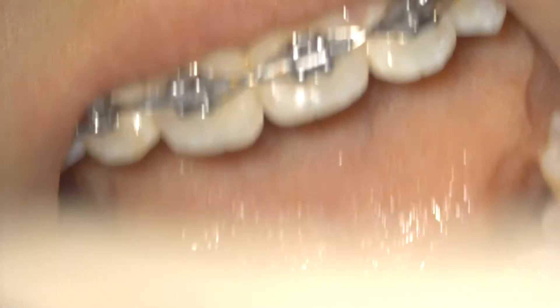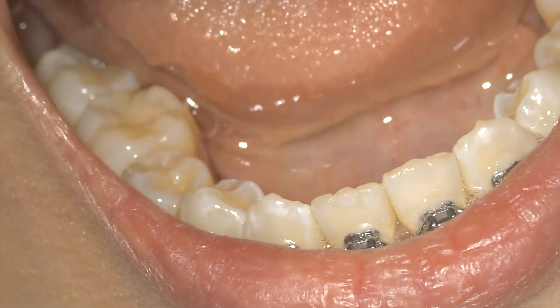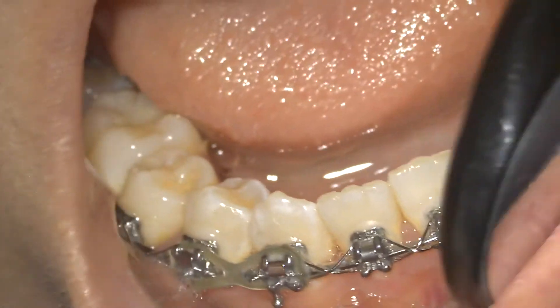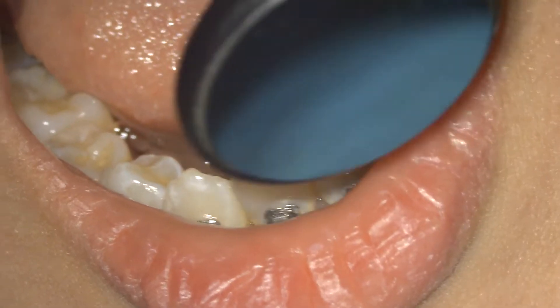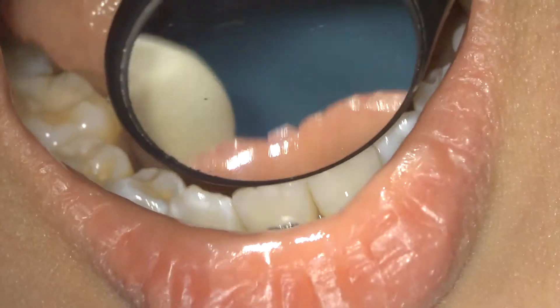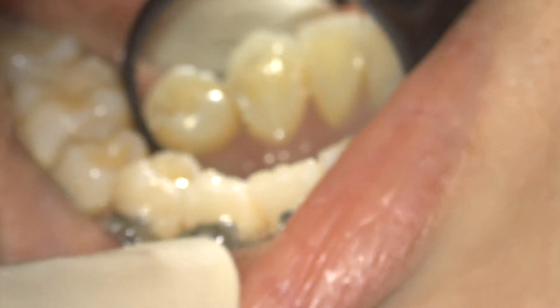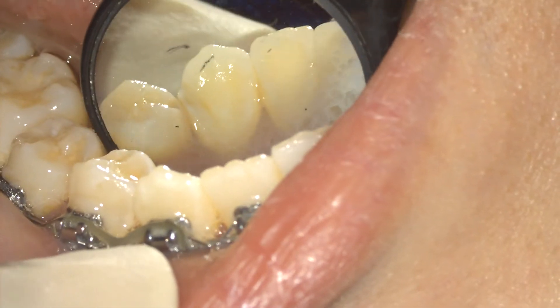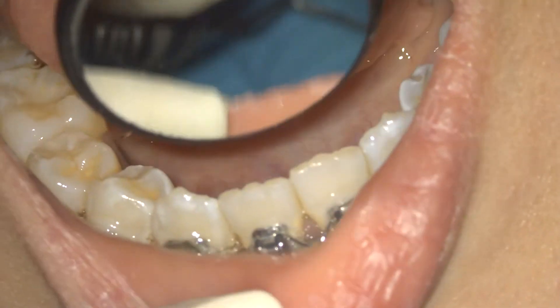Can you please open? As we can't appreciate much calculus on the labial surfaces here, I'm trying to focus on the lingual areas. The lower lingual teeth are a very common site for formation of calculus due to the presence of the submandibular gland duct.